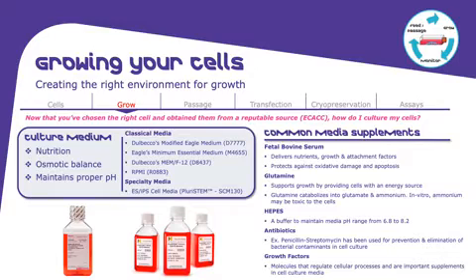The next step is to acquire all the media and supplements which are necessary in order to grow the cells. As you know, cell culture media provides nutrition, provides osmotic balance, and also maintains the proper pH. There are a number of classical media and special media depending on the cells you will be working with. It's not a secret.